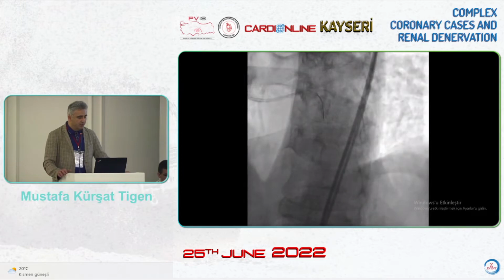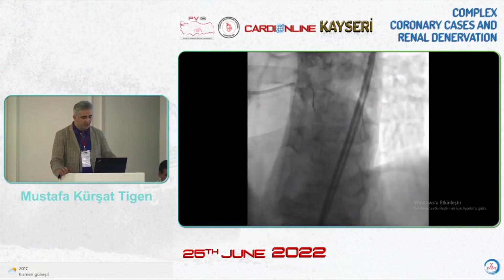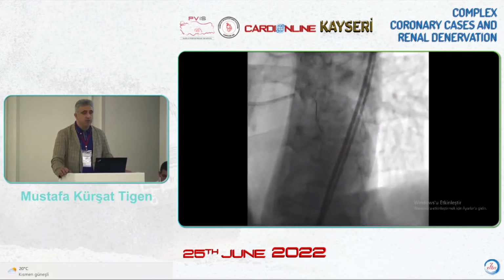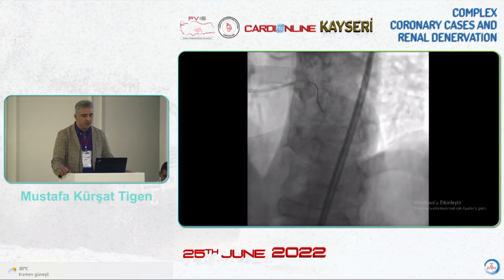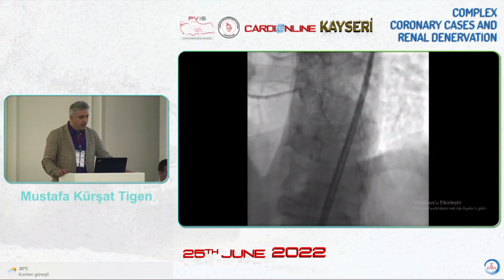And of course, after that is conducted, you can see the crossing of the wire. You can just follow it. With the microcatheter, we support the wire, and the penetration capability increases.